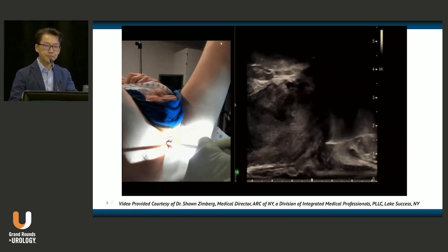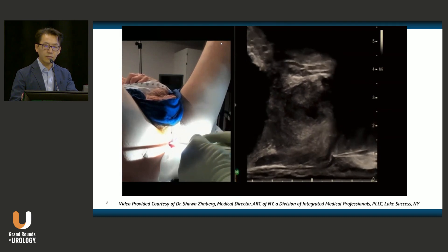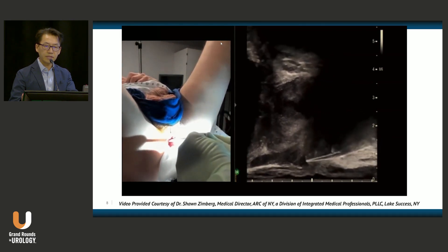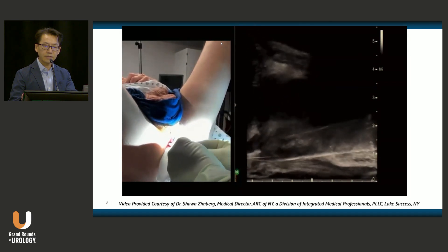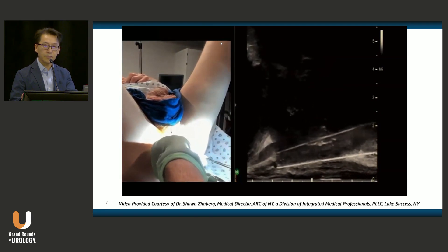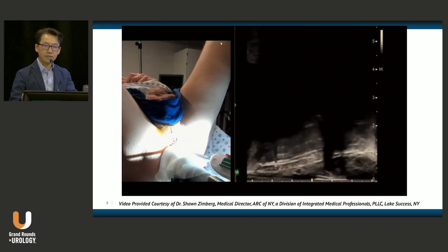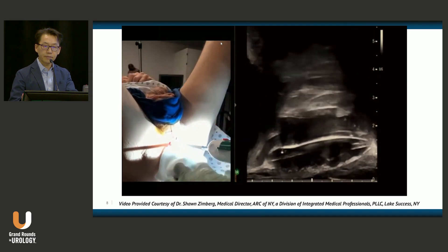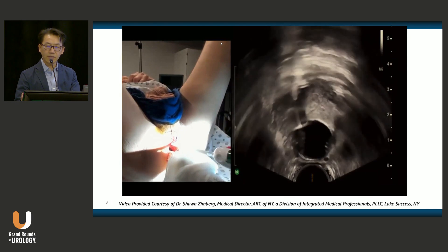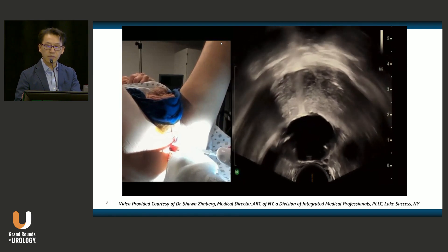The patient can be done under local or general anesthesia. You introduce the 18-gauge needle, and then — as you'll see here — a small incision is made and the dilator device is introduced. Once the dilator is in, you push past the rectal hump, enter the pararectal space, and perform essentially blunt dissection. All of this is done under transrectal ultrasound guidance. Once the dilator is satisfactorily positioned around to the base of the seminal vesicles, the device with the balloon at the tip is attached. You then remove the dilator, leave the sheath in place, and expand with saline. You maintain full visibility of the prostate, and can visualize and adjust the balloon position under ultrasound guidance as it is being inflated.